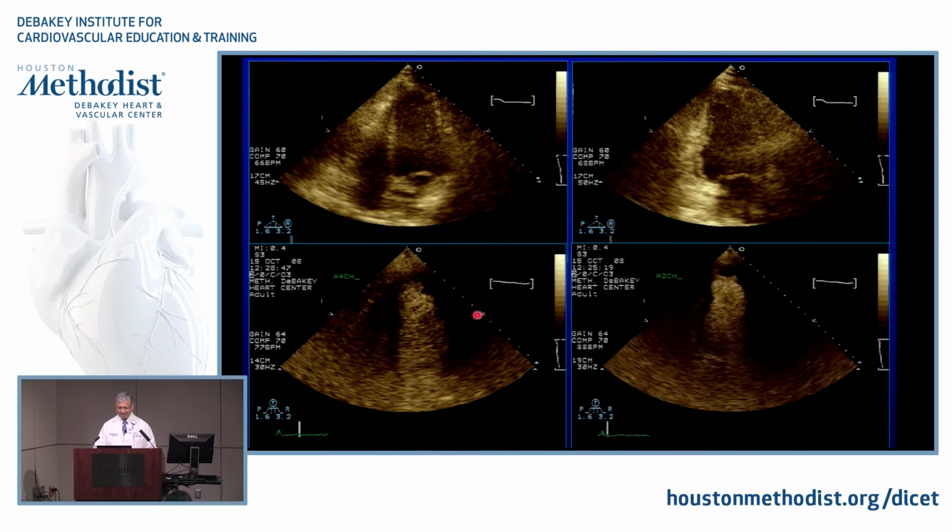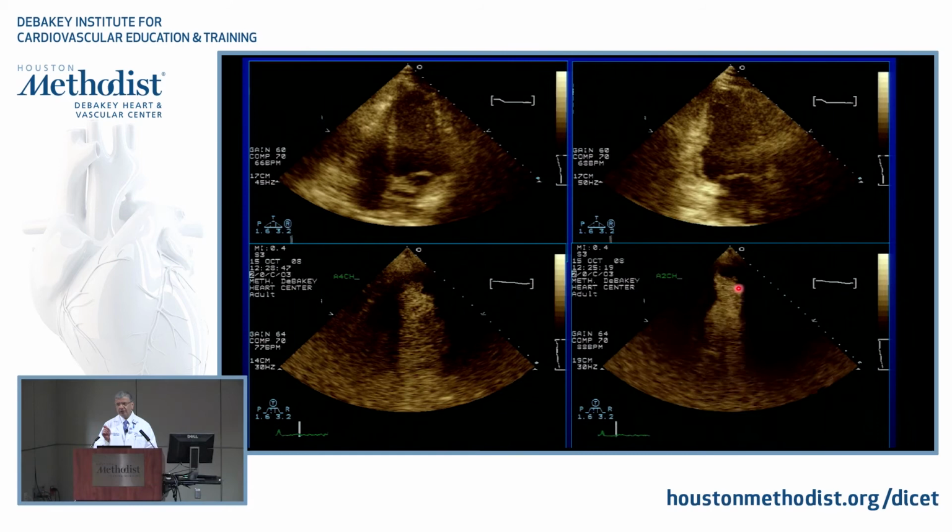Oh, light. Tyree, can we do anything with the light? But watch. Apical thrombus on top of this apical abnormality. So you missed two out of the three. And again, it tells you the situation is if we're not seeing, you can't interpret. No, you can turn it off. I think it's good. I don't mind it. Is that okay, Tyree? Yep. But you could see what I'm talking about here is right there.